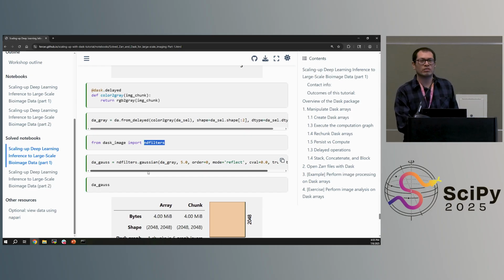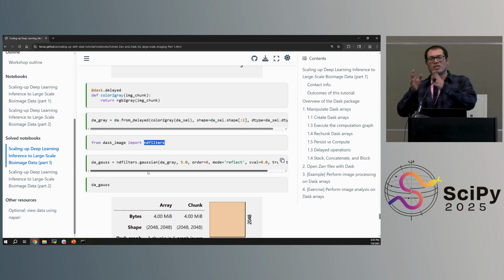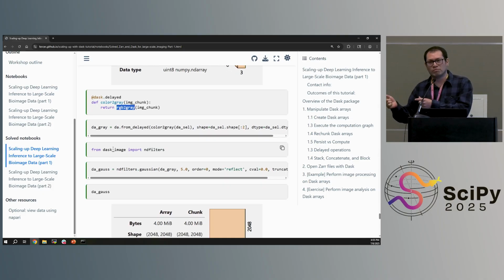Is the downsample operation already coming from the microscope or the instrument? Well, it is an intermediate step: when the SVS file is generated, most probably the acquisition software is creating and storing those pyramids. But if you don't have that, there are conversion tools that will convert the image into an open source format, and they can compute those pyramids for you.